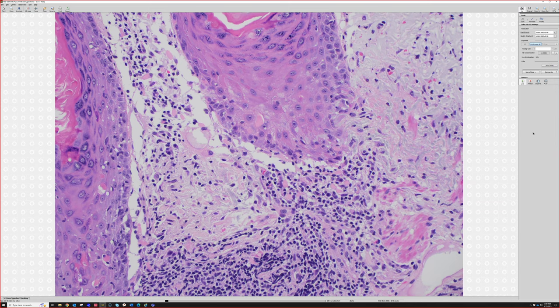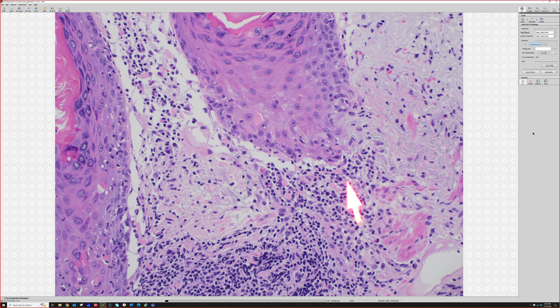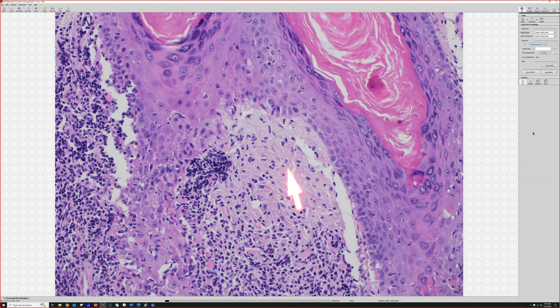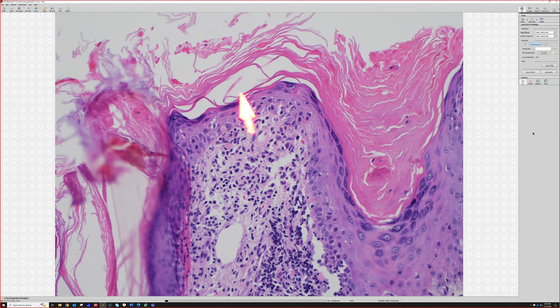Lichen planus doesn't usually involve the follicles very much, but I've seen examples that did, that fit for lichen planus better clinically and were not lupus. But here, look, we've got apoptotic keratinocytes or cytoid bodies, vacuolar change, a ratty, ragged, disrupted basal layer instead of the nice clean basal layer like we saw over on the right there. This is interface dermatitis involving the hair follicle epithelium, and it's also involving up here the epithelium of the epidermis.